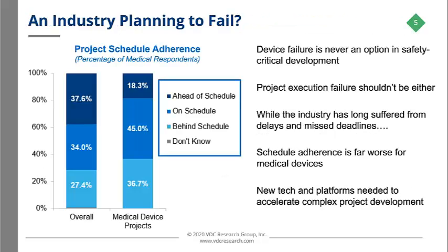Device failure is never an option, especially when you're thinking about safety critical development. So we shouldn't accept project execution failure either. Somehow people have taken this dynamic and that potential outcome for granted. While the industry as a whole has really long suffered from delays and missed deadlines, schedule adherence is far worse for medical device development. As you can see here on this chart, 37% of projects were reported as completed behind schedule.